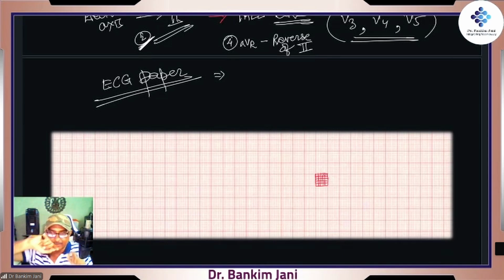Same way, there would be a needle, right? It will start moving. Because the needle is moving at one point only. As the current comes, it moves. The current goes, it moves. Right? So the current keeps on coming, and the paper is moving. So that's how it is. The needle is going like this only, but because the paper is moving, it is giving all these waves.